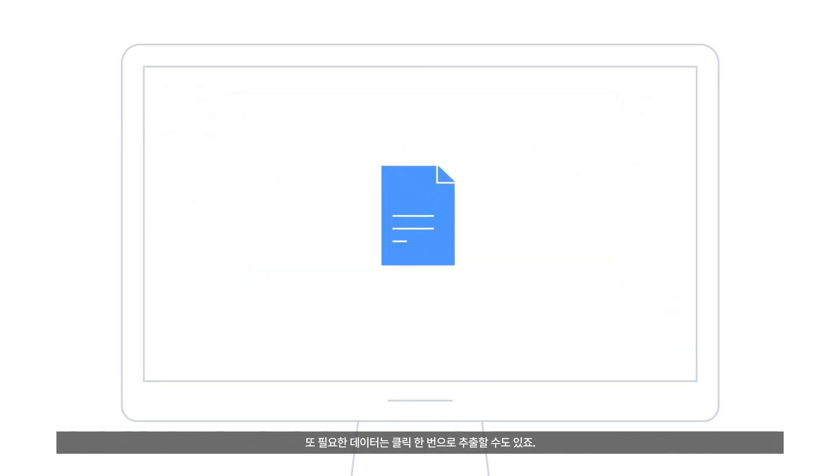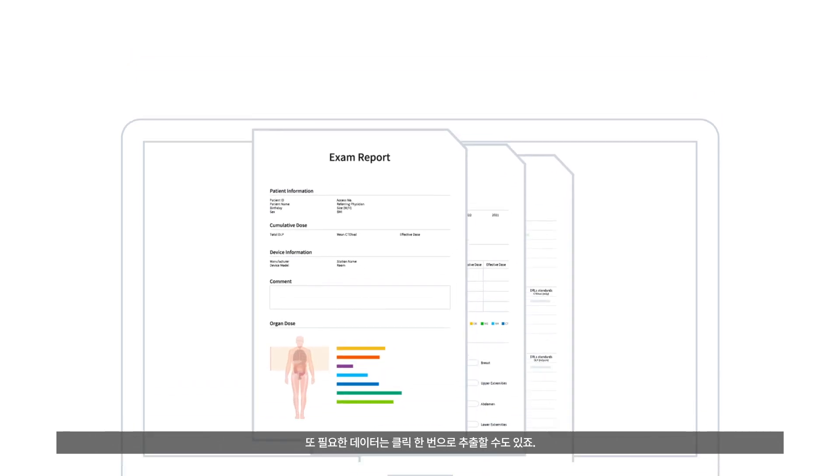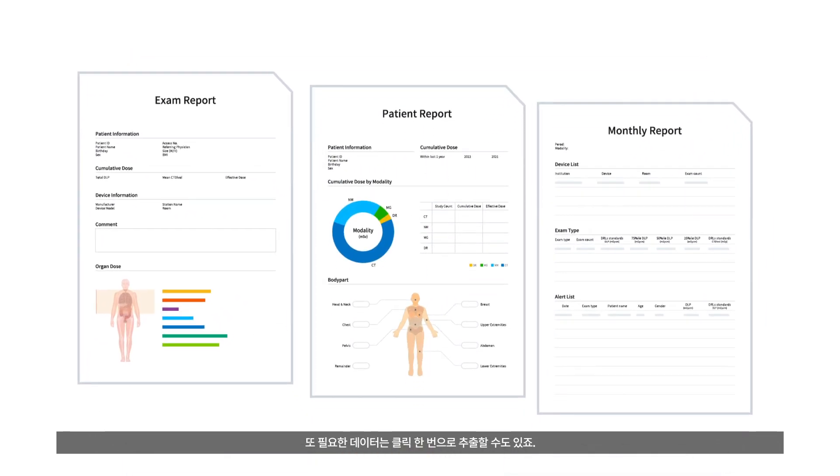And for reporting, you can easily export whichever data you need with just a click of a button.